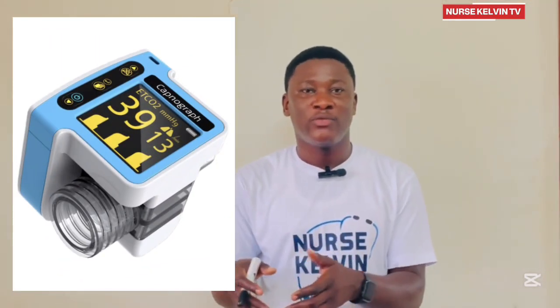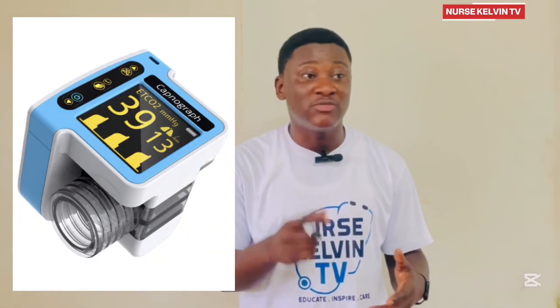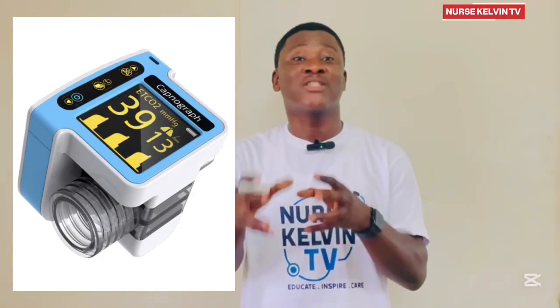Then we have the capnography. When we talk of the capnography, it is a device that measures the concentration of carbon dioxide in exhaled breath. When the patient breathes out, this device is going to measure the concentration of carbon dioxide in the exhaled breath.